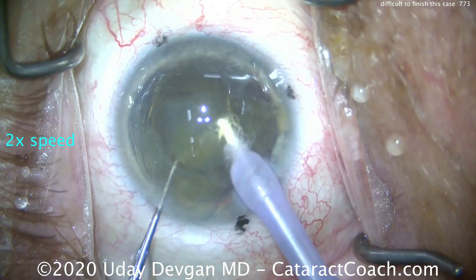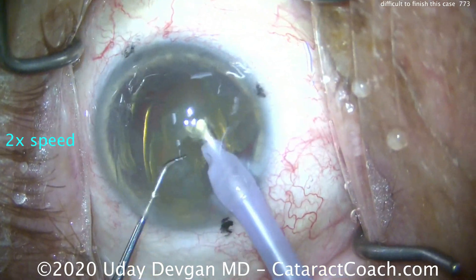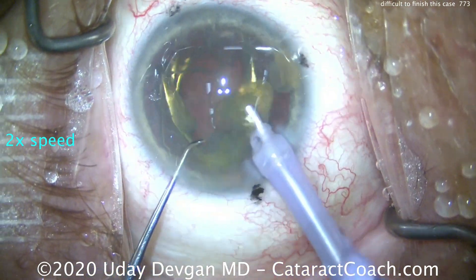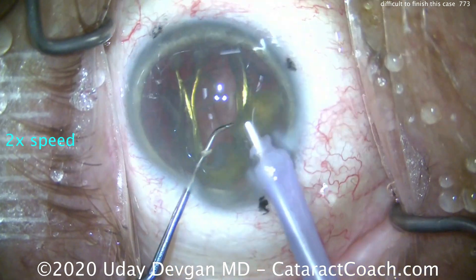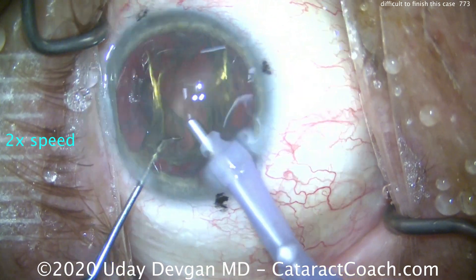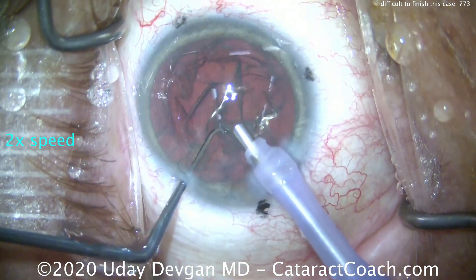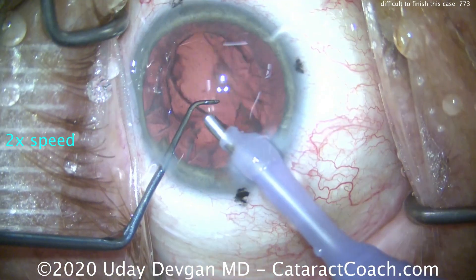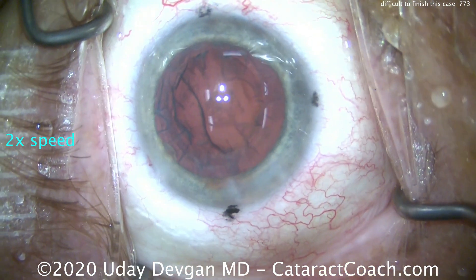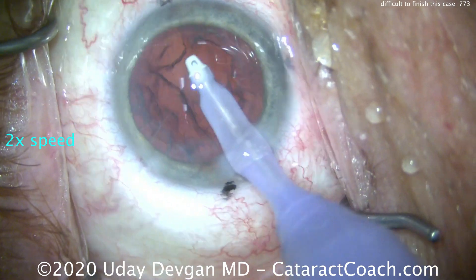Part of the challenge — the minor part — is that it's a very high-profile patient in our practice and a very important patient for us to get a beautiful outcome. The real challenge is that the patient hadn't told us, and we find out only afterwards, that the patient was in an accident where he got hit in the eye and sustained a little bit of zonular loss. Not much — in fact, when we created the capsulorhexis, it was totally normal. So let's watch now during cortex removal. Nucleus is out, very efficient. We're showing you the whole case, nothing hidden.